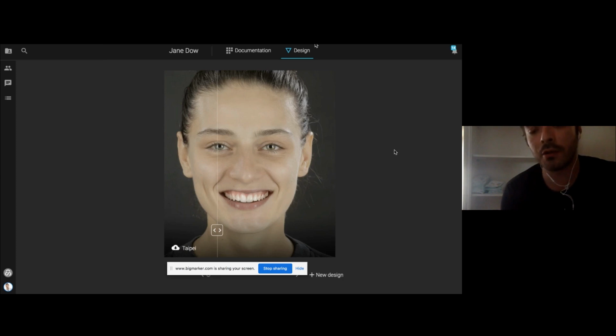You do it, call the patient in, and then the patient says, yes, but I was thinking about something else. And then what do you have to do? You have two options. You can either go and manually start to change inside the mouth, which does not really work very well most of the time, or you reschedule and you do the process again.